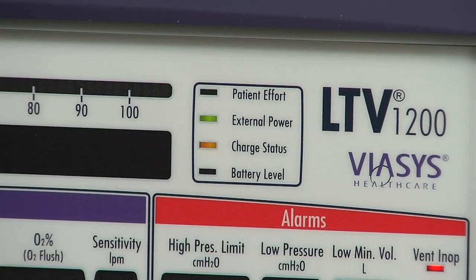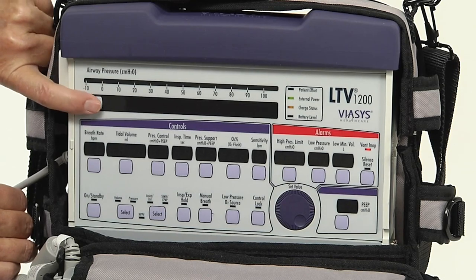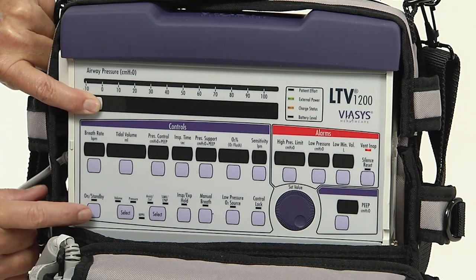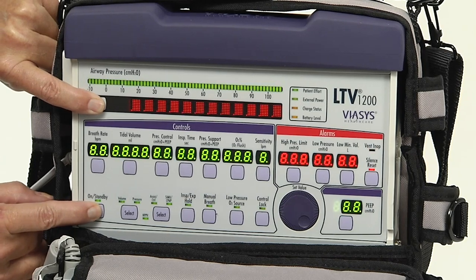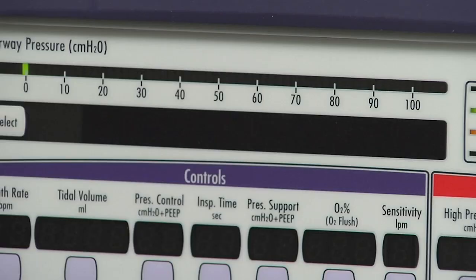Verify that the external power and charge status LEDs on the front panel are illuminated. To begin vent operation checkout, push and hold the select button, then continue to hold the select button and press the on/standby button. 'Remove patient' should be displayed.